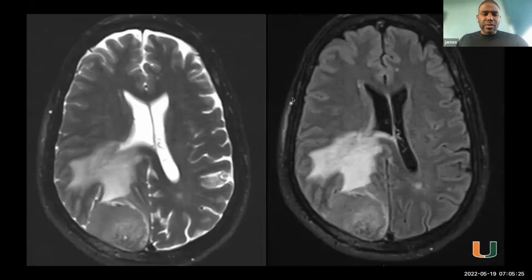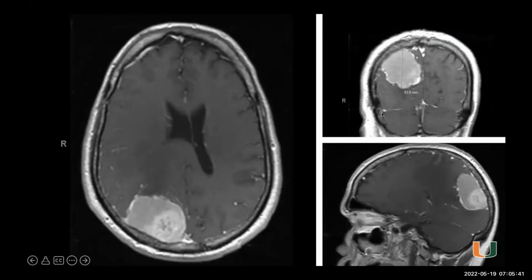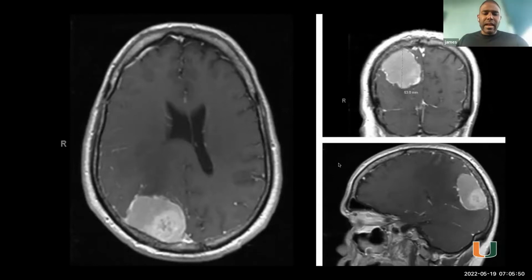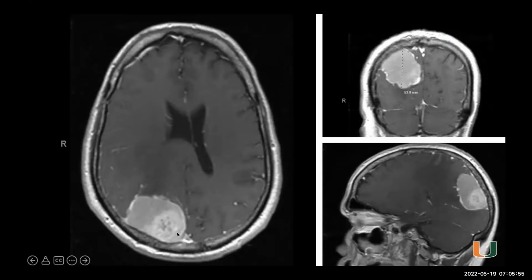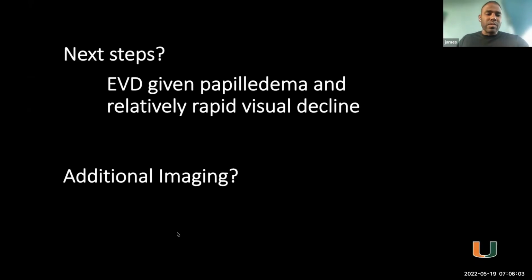And then I'll show you the scan real quick. Any additional imaging you would want for this, given location and such? Yeah, I'm not really sure there's any other images that I would do for this, honestly. Okay. On this axial cut, you see on the most medial aspect of the tumor, it's abutting what? Oh, you mean MRV? Yeah, exactly, man. That's also what was done.